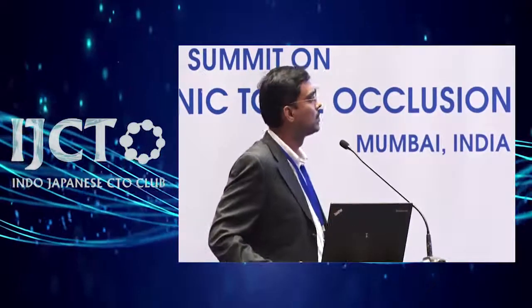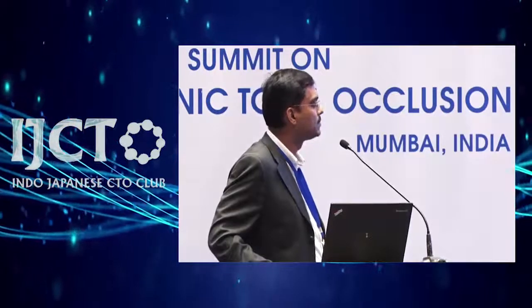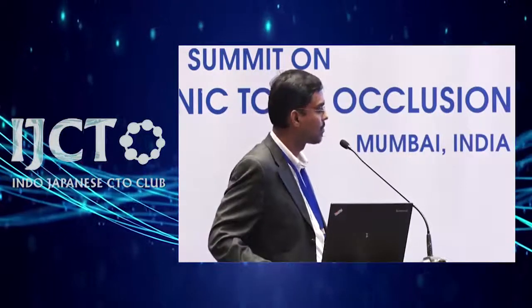A very nice presentation. You explained very clearly, especially the video was very explanatory. Just two comments on this. As you rightly said, when you're using a 7 French guide, the sheath you take where you want to do an extension is 6 French. And the dilator has to be 7 French, so the dilator has to be 7 French from both sides, so it can fit snugly into it. That is one.